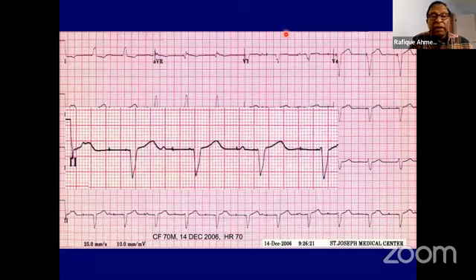Number two, let's say a 70-year-old comes to me totally asymptomatic, and the pacemaker has 2 years of battery left. What I may do, I will tell the patient, look, I know the atrial lead is not functioning, the ventricular lead is working, you are doing well. Let's wait until the battery runs out, and at that time I'm going to put in a new atrial lead. So that's an option. And the third will be, you can make a clinical decision after discussion with the patient. Look, just leave it VVI and the patient will do fine.